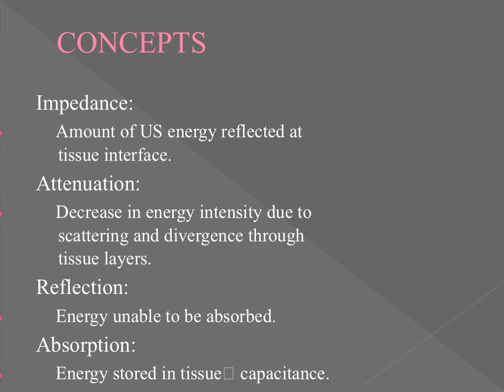So when we think about impedance, we have to think about what things would highly impede an ultrasound treatment. I'm going to let you sit on that. Maybe pause the video and think about it. What things in the patient ultrasound treatment world would impede the ultrasound's ability to deliver the maximum energy intensity? Did you say ultrasounding near a bone because it's going to cause transverse waves?